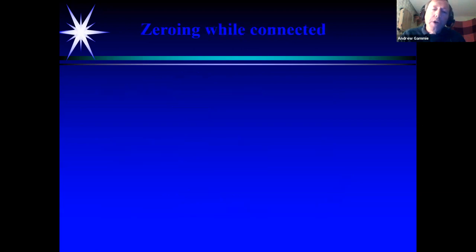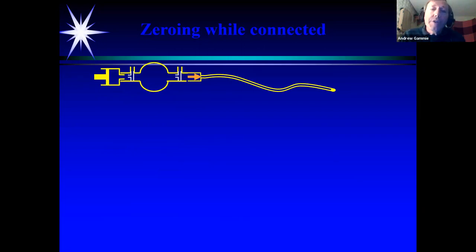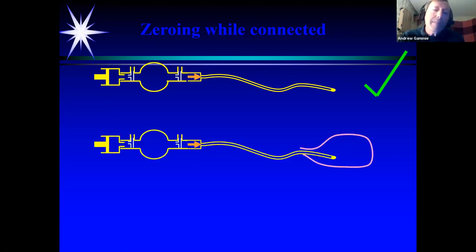Just perhaps to clarify that, I'll finish off with this issue about zeroing while you're connected to your catheter or water-filled tube. What happens here? Well, we've got our syringe cut off from the dome, and we've got our water-filled tube cut off from the dome. So I can wave it around the room if I like, and there's no effect from the tube onto my transducer dome here. It means that if I hit zero now, I'm correct, because I'm only measuring the atmospheric pressure at the time. What happens when it's in the patient, though? What happens when your patient squeezes in this case? Well, the pressure would come up the water tube, but it would not get to the dome. I've still got atmosphere only on my dome. So that's fine too.